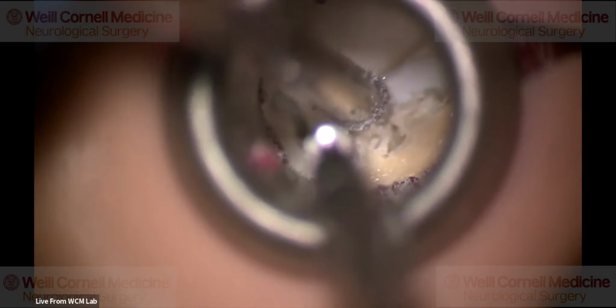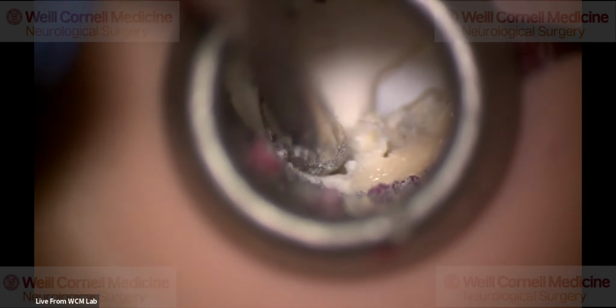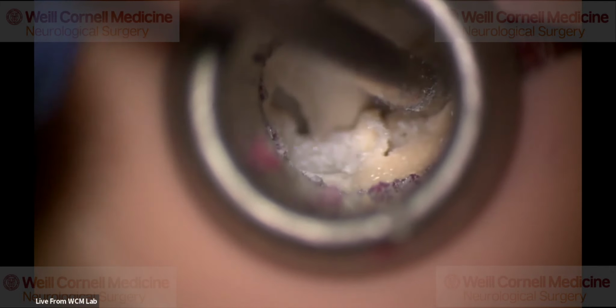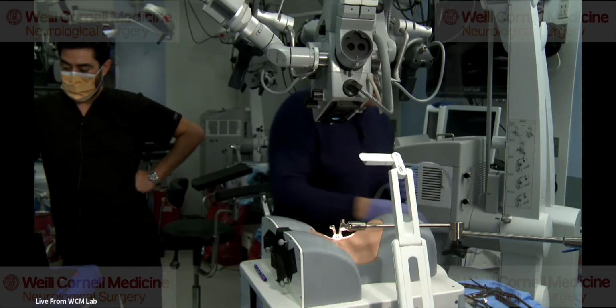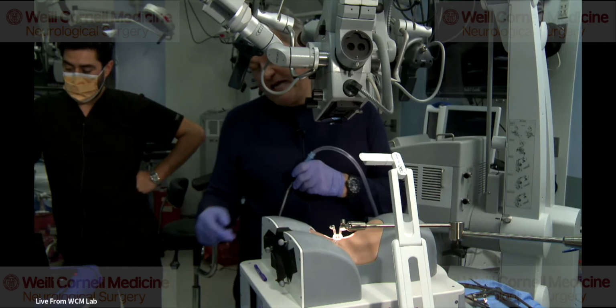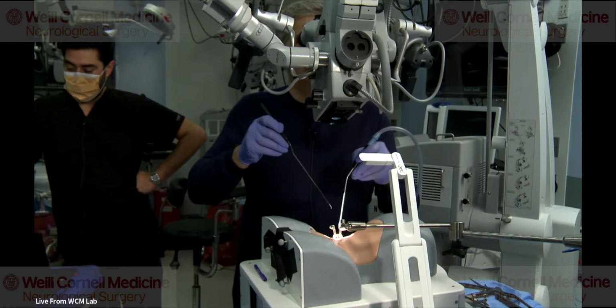So now again, I protect the nerve root with my suction. I drill here. So I remove the medial aspect of the facet. So that's the IAP, and then the SAP is below. And you have to remember, obviously, that the nerve root compression is really from the SAP, right? So I use the ball tip again here.